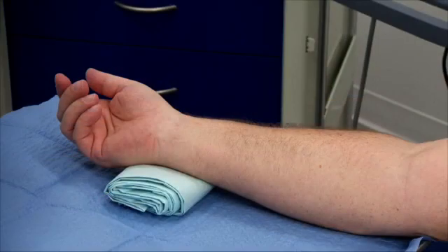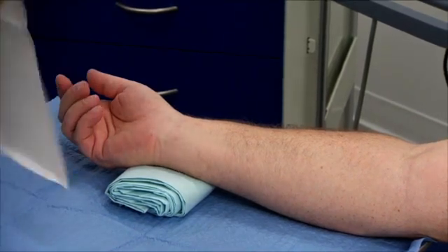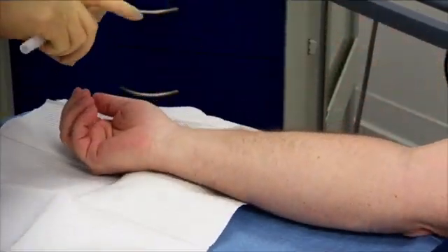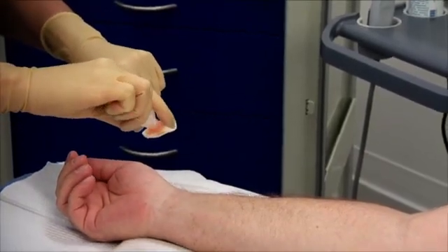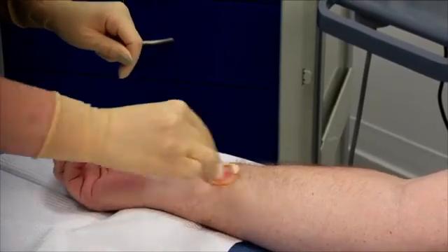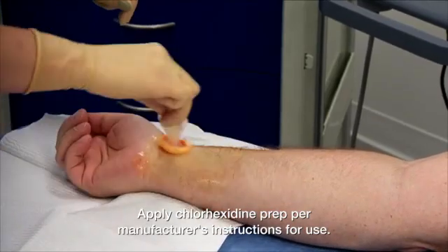Next, you will want to prepare the extremity for insertion. Position the wrist in dorsal flexion to bring the artery in closer proximity to the skin. Prep and drape the insertion site per hospital protocol. As part of any CLABSI prevention bundle, use a chlorhexidine-based skin prep as recommended by the CDC guidelines. Use a scrubbing motion to create friction, and allow the proper drying time per manufacturer's instructions for use.